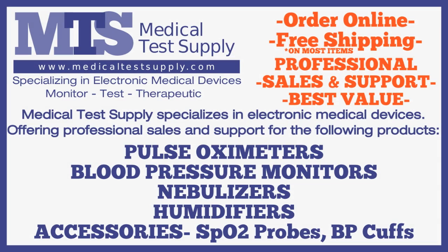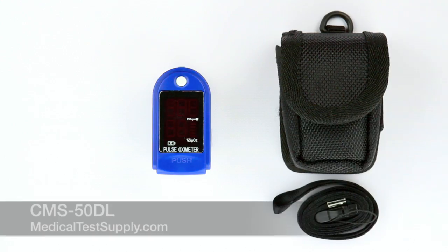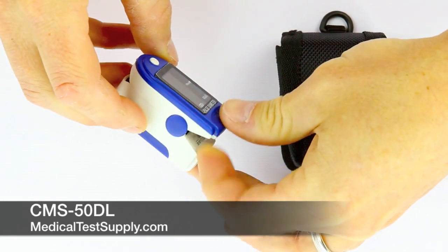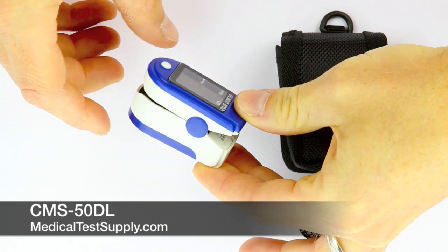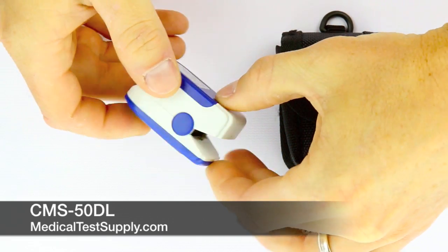Hi, my name is Guy from Medical Test Supply. This video is intended to give you some basic guidance on purchasing the best oximeter for you or your patient. The first oximeter is from MTS, part number CMS-50DL. It's our most affordable, reasonably priced oximeter and represents a great value.